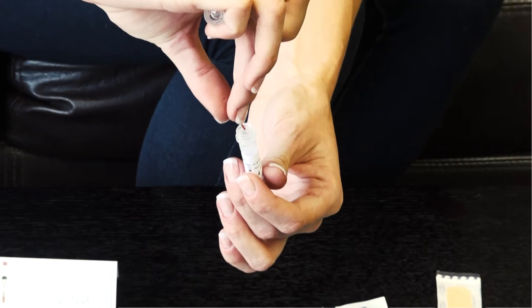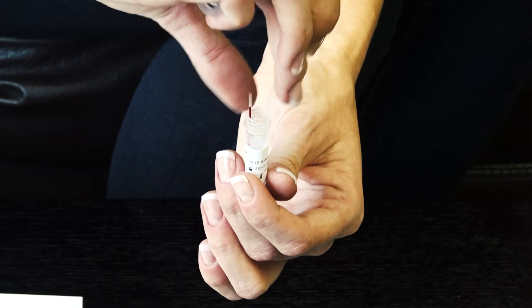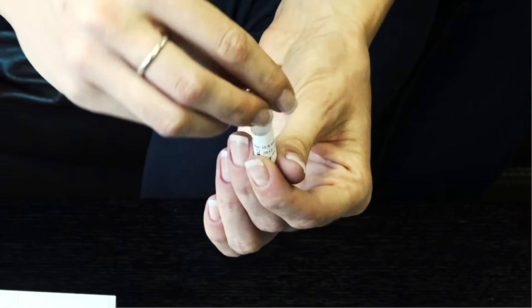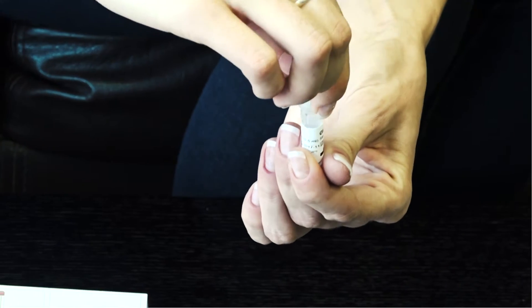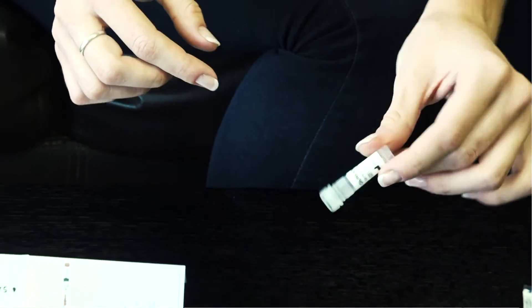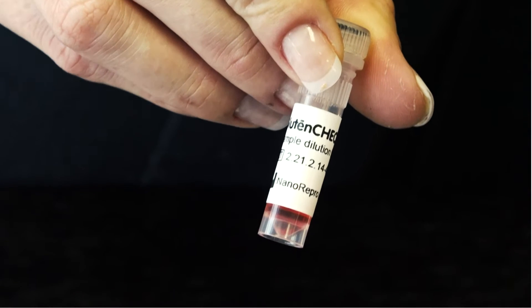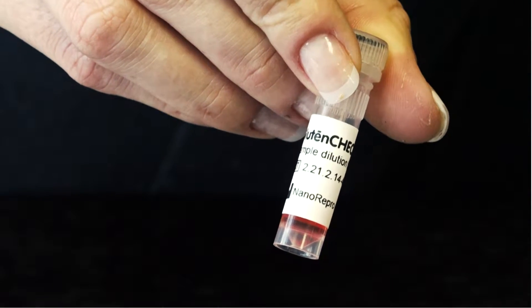Step 6. Insert the filled glass capillary into the solution bottle and screw the cap back. Mix the content of the solution bottle by turning it gently upside down several times until the blood from the glass capillary tube is mixed with the solution.